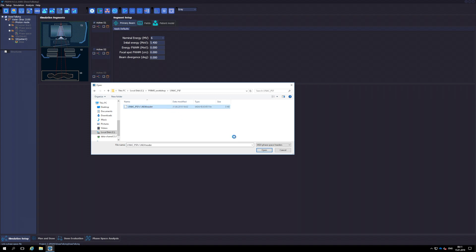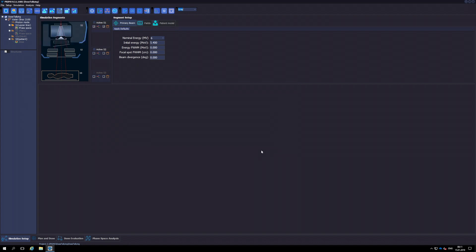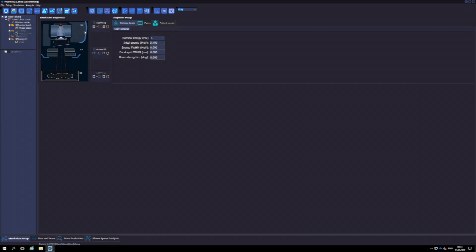It is possible to link multiple phase space files provided they and their respective header files are all located in the same directory. To link multiple phase spaces, it is necessary to do a multiple selection of headers by keeping the Ctrl key pressed while clicking the files.